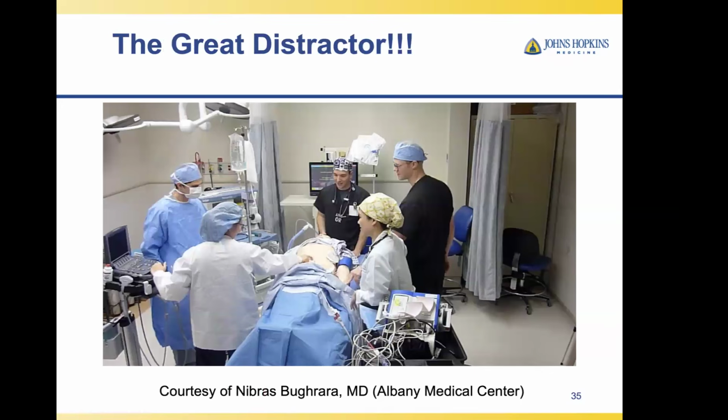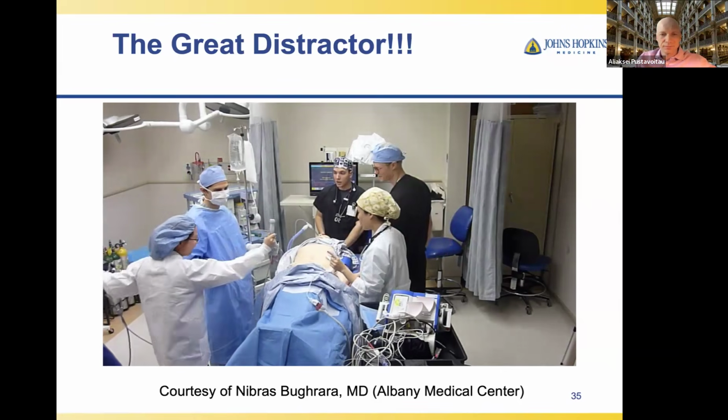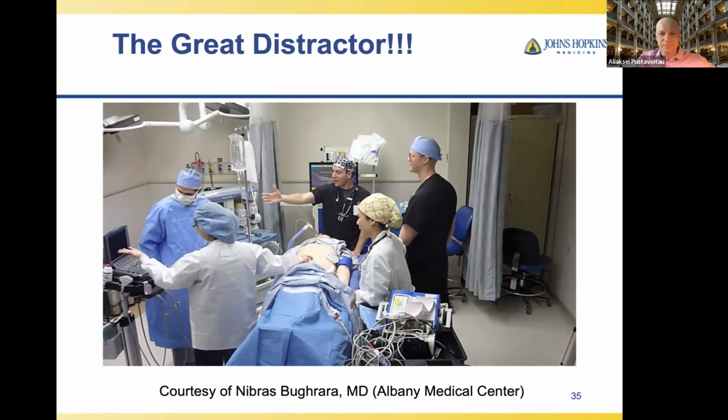Let's see how it looks, right? It can also become a great distractor. And that's what I mentioned, that we can extend the pauses tremendously. So like this group performs CPR for 2 minutes, and now all of a sudden they do ultrasound and see what happens. There's a heart. Good.